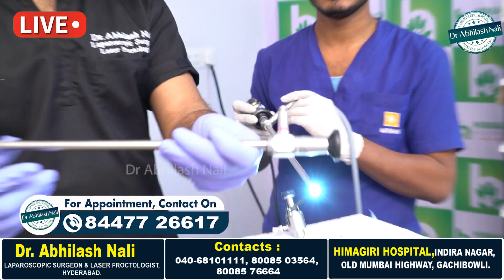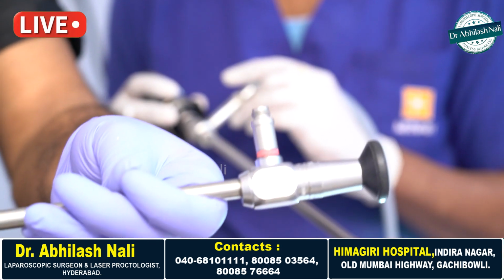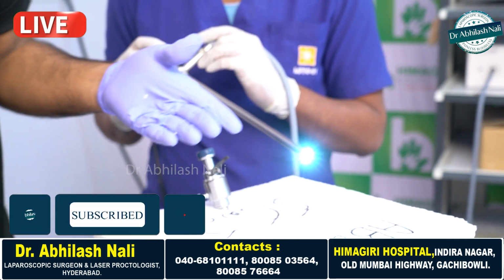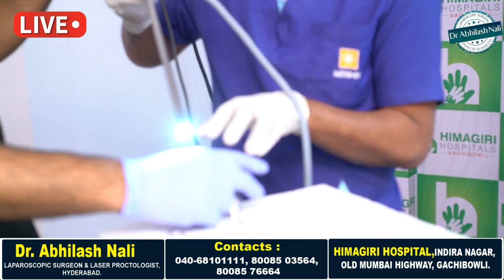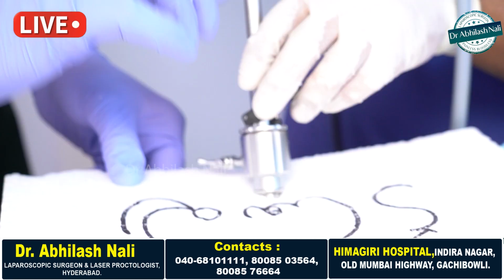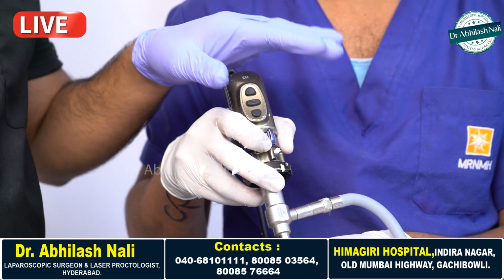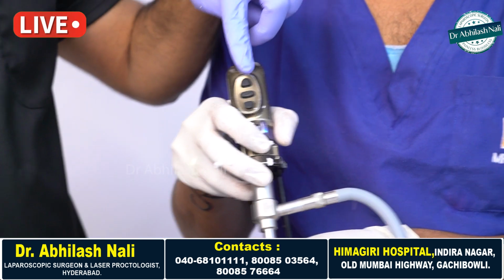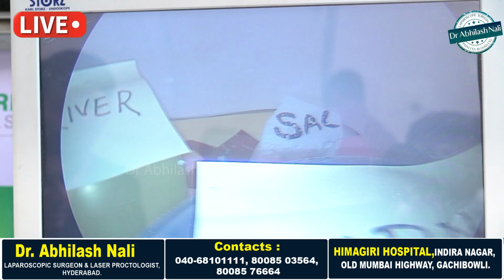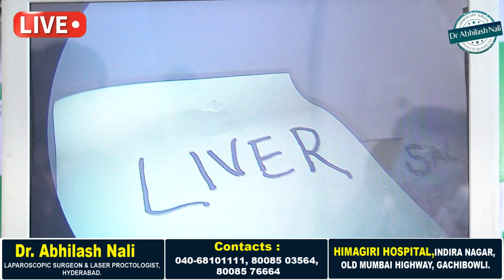You can see this is one of the reputed companies, the internationally renowned camera, because this camera quality actually decides the outcomes of the surgery. The better the camera clarity, the better the surgery and the comfort for the surgeon. In laparoscopic surgery, this camera will be introduced into the abdomen and connected to a monitor, to demonstrate what exactly is happening inside the abdomen.